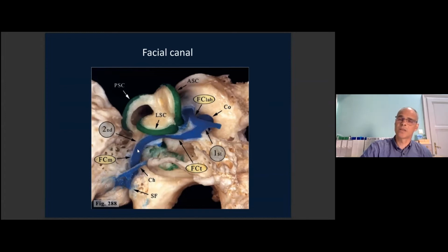It is always a good technique. How can you find, during mastoidectomy, or how can you make a good posterior tympanotomy and the whole mastoid portion of the facial canal? So we have a labyrinthine portion, tympanic, and vertical mastoidal portion.